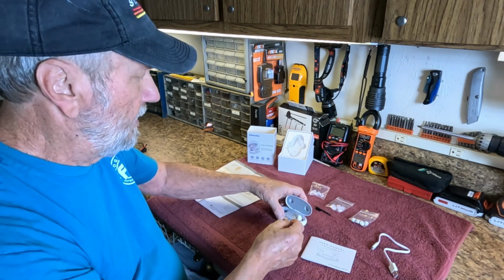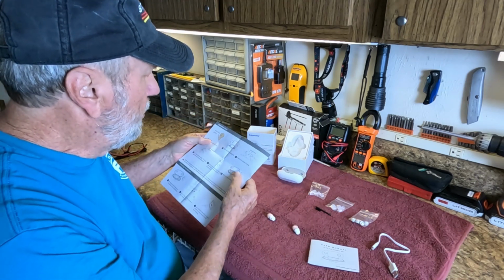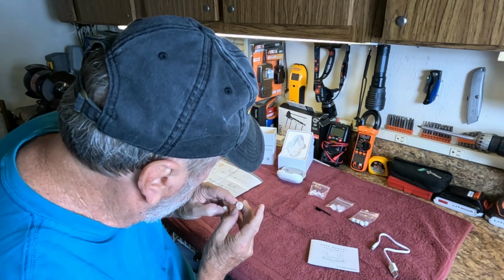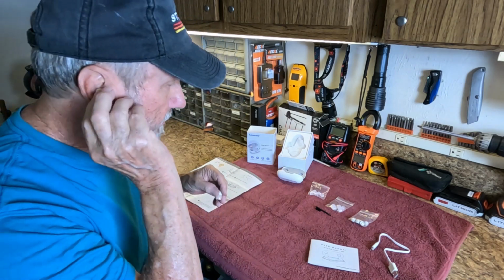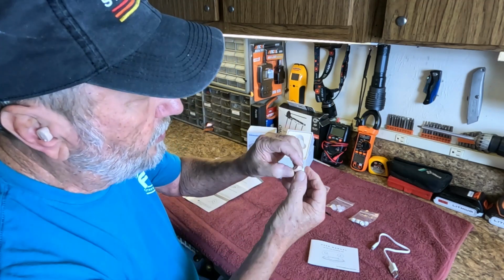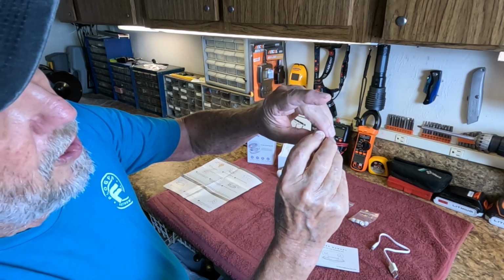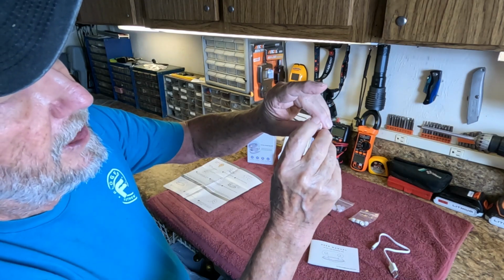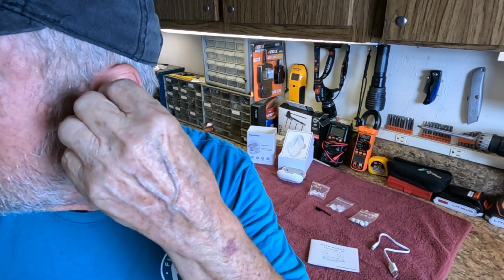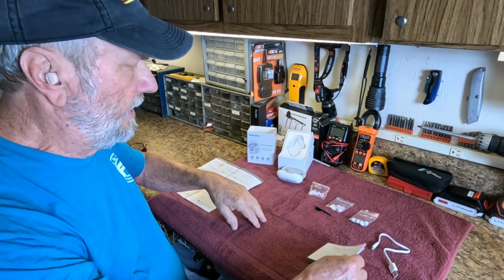So the first thing it says to do is take them out, pull that off, and then you should try them on. And actually you want to put the R in the right ear like this, and this one in the left ear. There's a button here and a hole there. You want the button down and the hole up. That's how they're supposed to go in your ear, like this. And that's the microphone up there. We're going to see this later in detail.